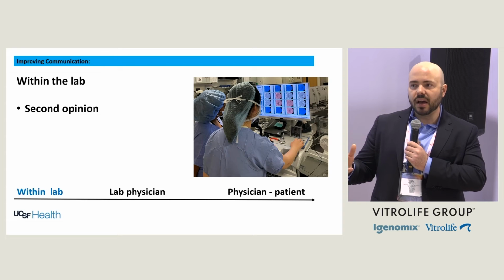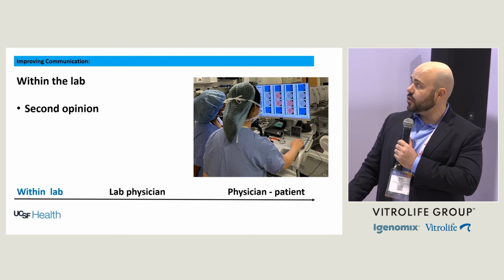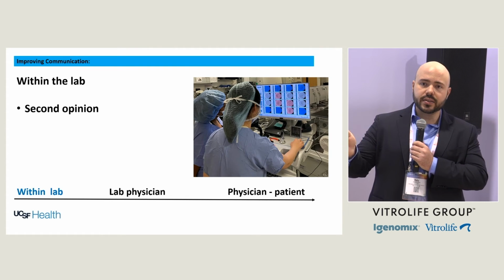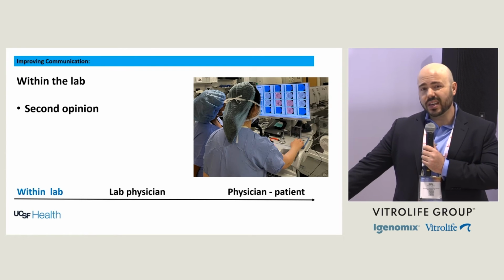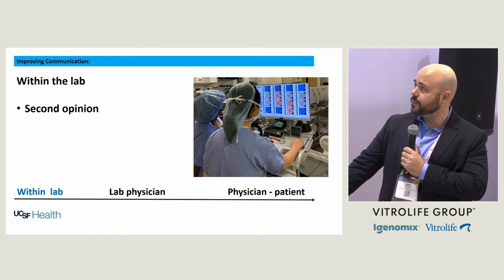Is this A or B or a B and a C between your grading, because you're right on the fence. So instead of taking the dish out and bringing an embryologist, you can just go to the image and revert the image and see how the embryo is being formed, and also the morphology, and whether this embryo would be good for a transfer or biopsy?